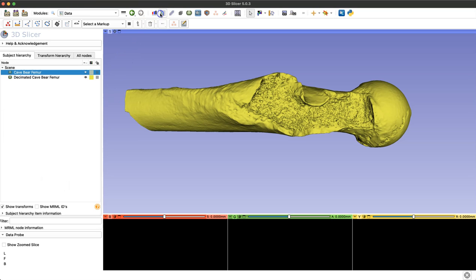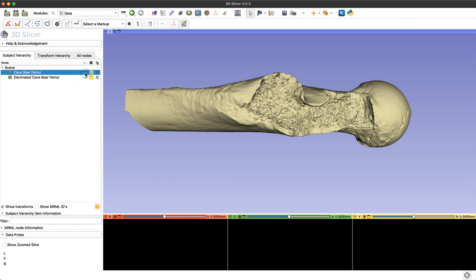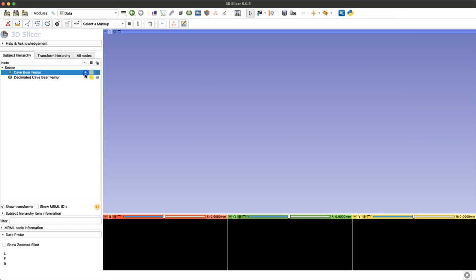This can also be done by navigating to the data module and turning on and off the visibility of those models with the eye icon.